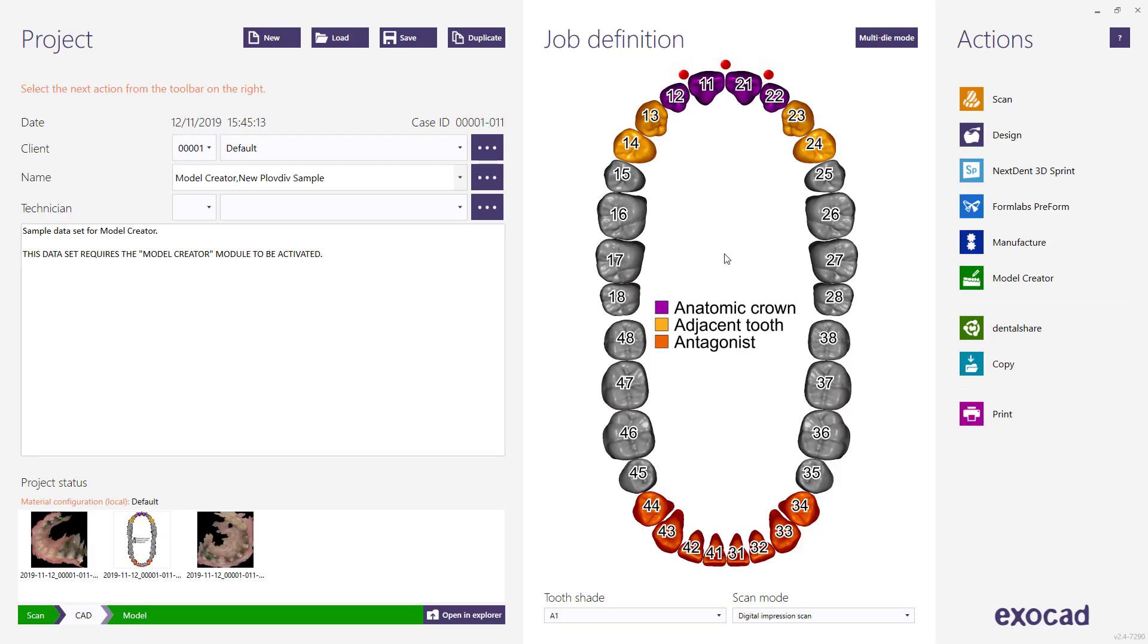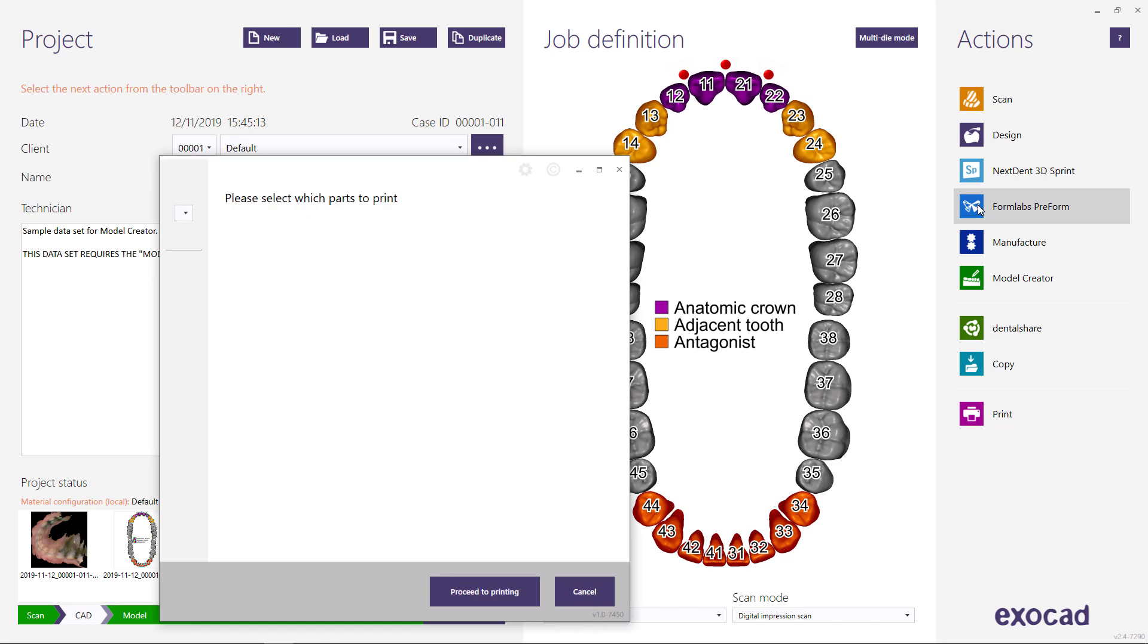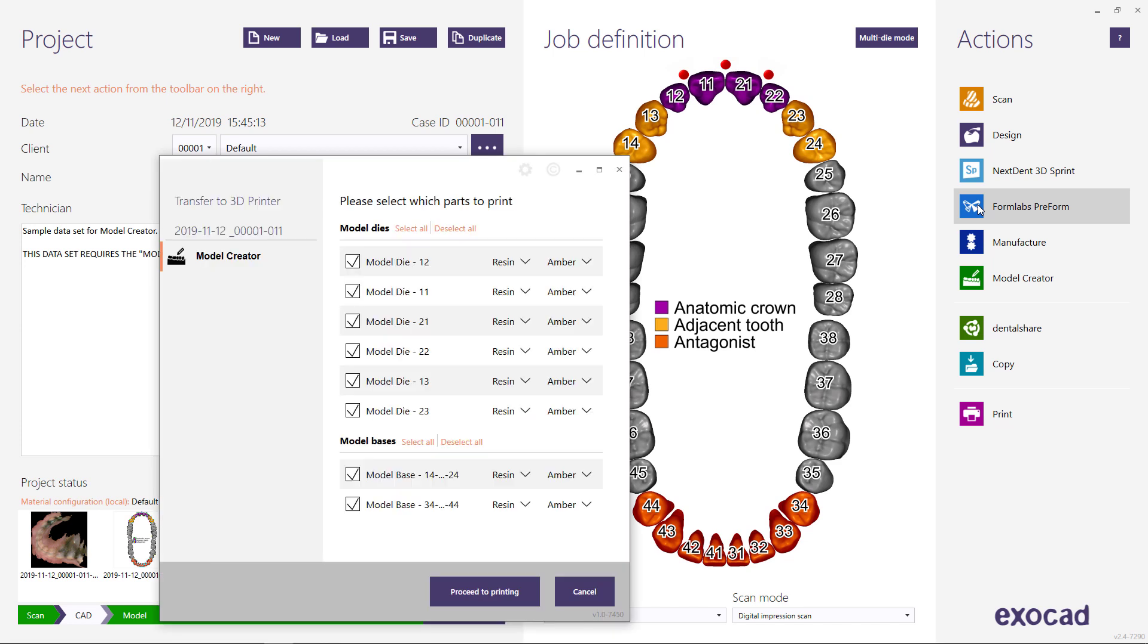Let's see this in action. In this video, we show the integration with a Formlabs printer, but our software supports smooth integration with printers from various manufacturers.